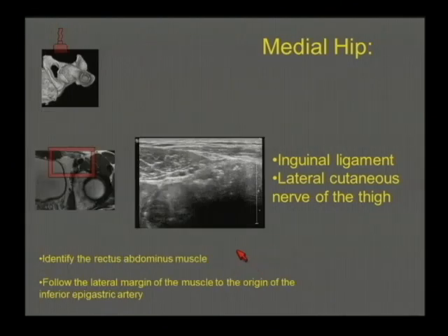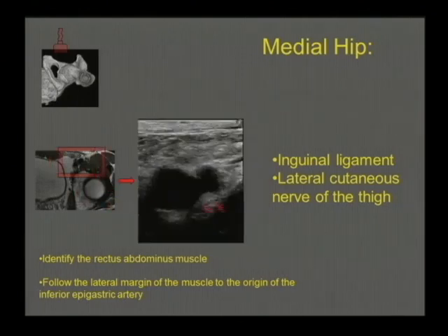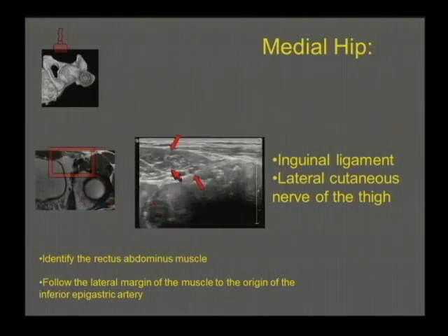So some of the landmarks I want to talk about here. We found the neurovascular structures earlier, and if you have the transducer transversely oriented on the patient and bring it a little bit proximally, you can find the lateral margin of the rectus abdominis muscle. Just deep to that is the inferior epigastric artery and some paired veins, and those are important structures to identify because they're going to serve as landmarks for where we're going to look for the presence of a hernia.